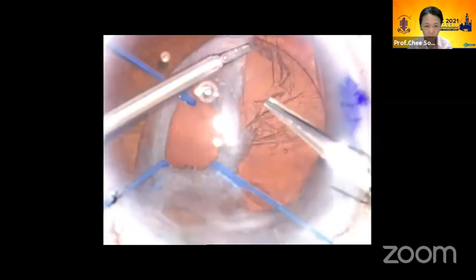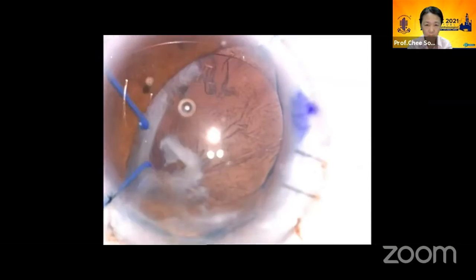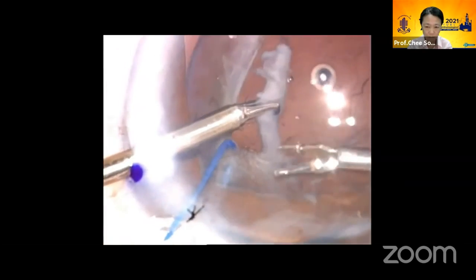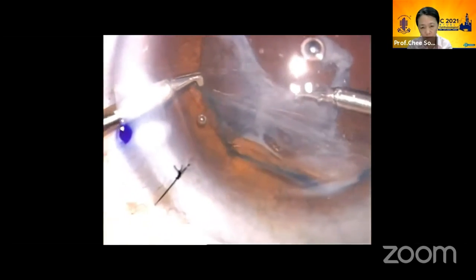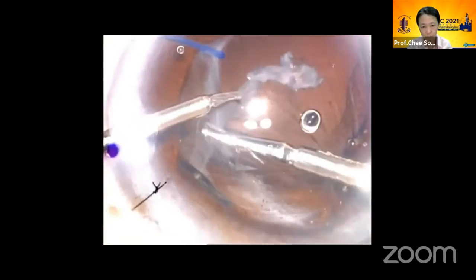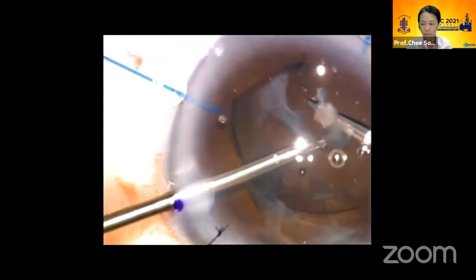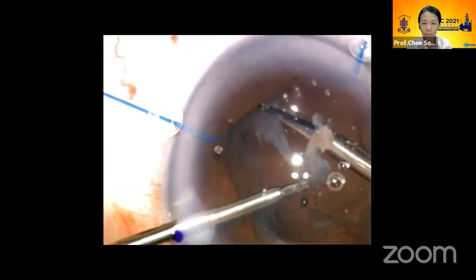And you can see we're making progress here. You can see the haptic being buckled forward by the severe fibrosis, and in areas where we cannot make progress, we cut the fibrosis to release it, and we use more dispersive viscoelastic to separate the anterior from posterior capsules that are held by adhesion. In this area here, you can see severe fibrosis that extends from the anterior to posterior capsule, and that's where I stop. I would rather truncate this fibrosis because you do not want to compromise the posterior capsule. And as we move around, again, we remove all this fibrosis.